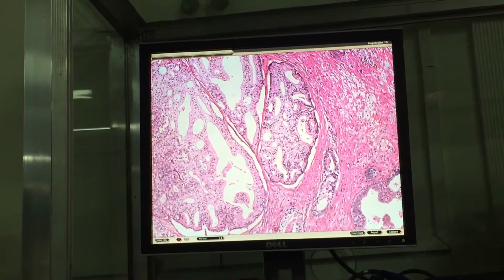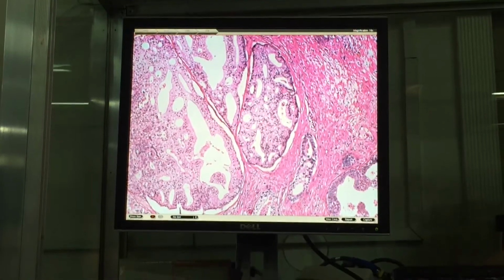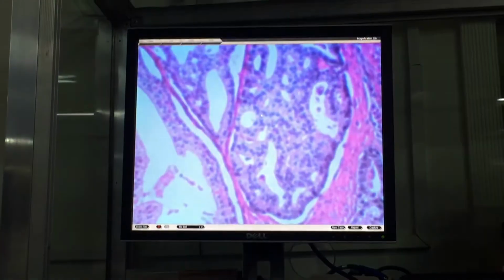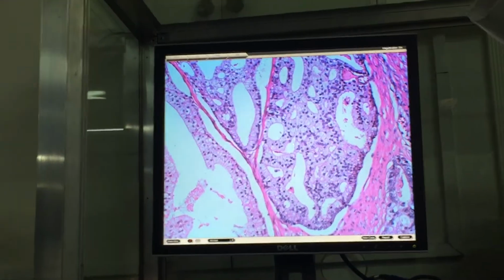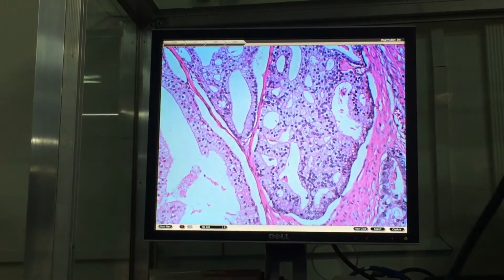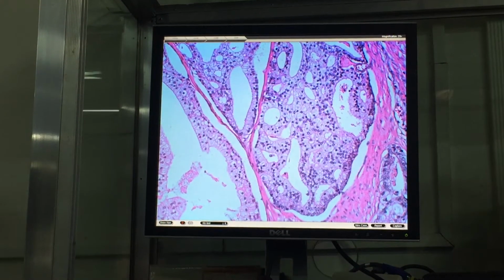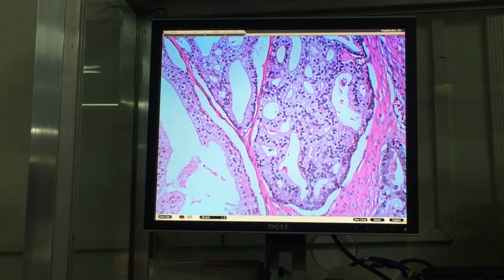See? Kanina, di ba, sa adenoid cystic, you see cribriform pattern. Also here, you see those cribriform pattern. At higher magnification, you'll notice that it doesn't only form intraluminal projections, but here, there's already connection. May nagdidikit-dikit na yung intraluminal projection, and it forms now several glands. Smaller glands within one large gland. That is your cribriform pattern.